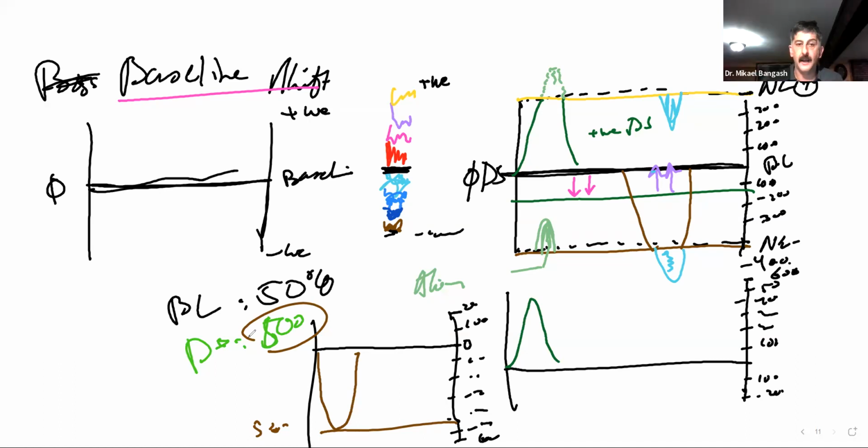So the whole point here mainly was, yes, we had a graph of a velocity of a Doppler shift. It doesn't fit in the frame. What can we do? The first was, yes, increase the size of the frame, by increasing the scale.